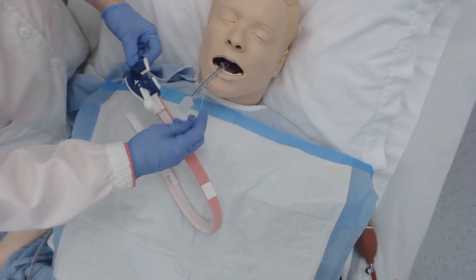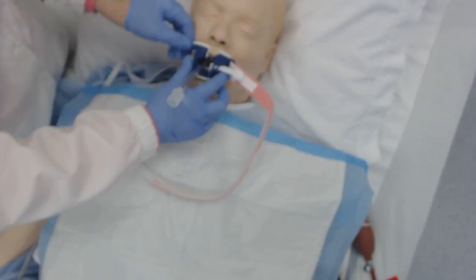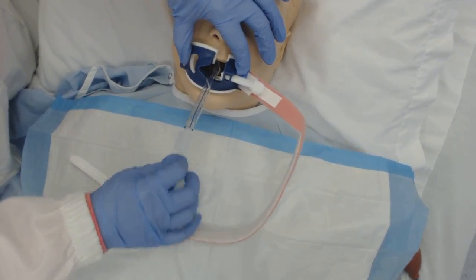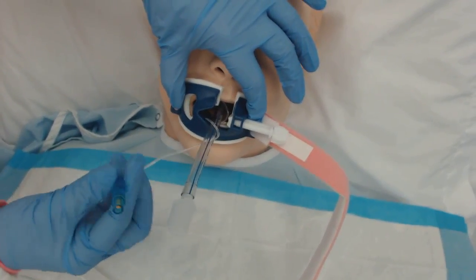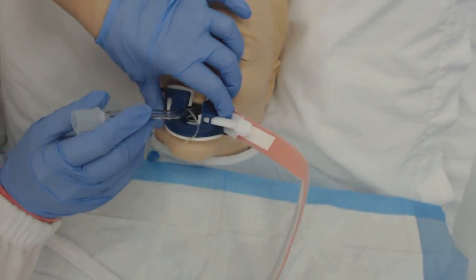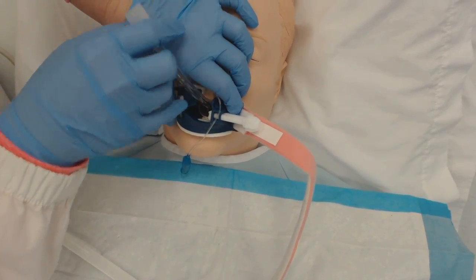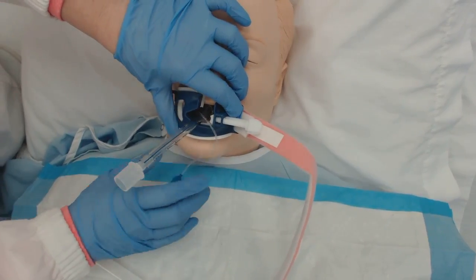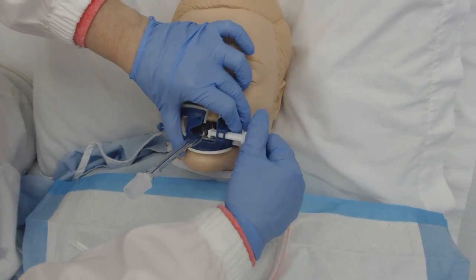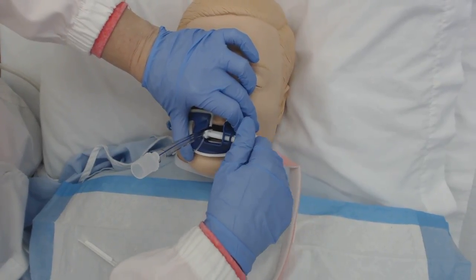You're going to make sure you know where this is. I'm going to place this here with the bite block in between their teeth. I'm going to make sure that this balloon is a little bit taut, but not too taut. There are numbers on here — this is at 20.5 at the lip line. That's going to be important to know.